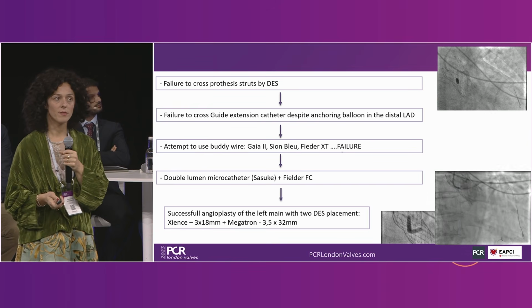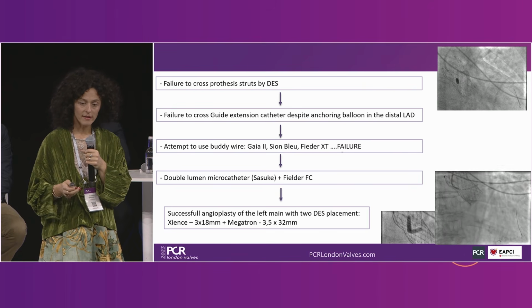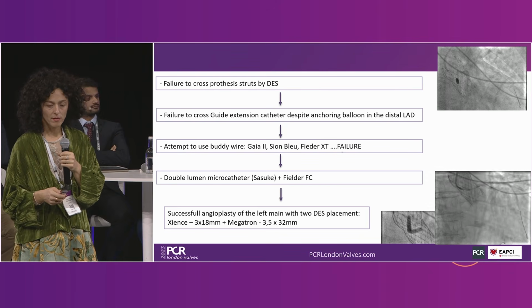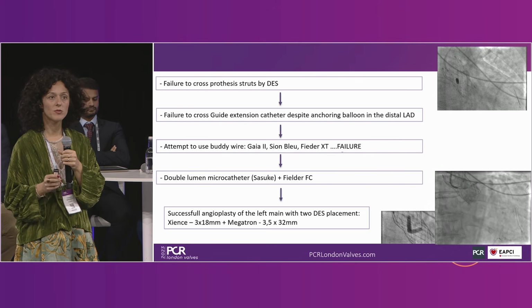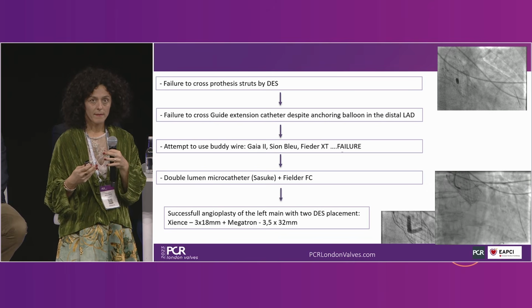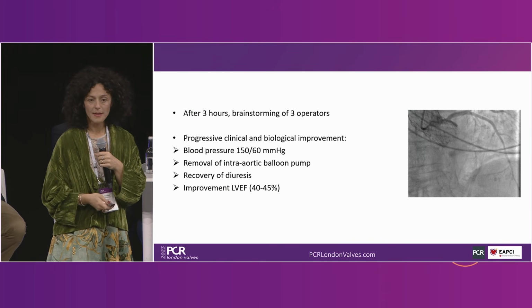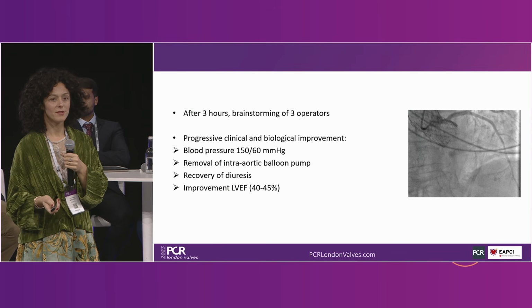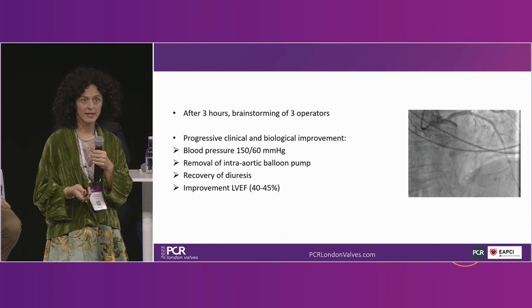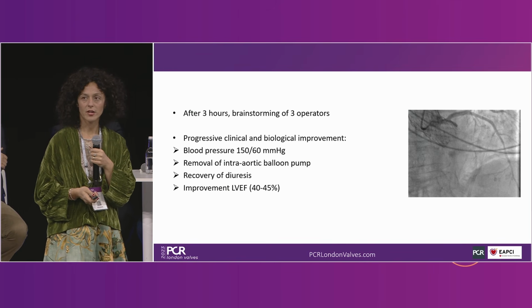this coronary ostium and reperfuse the left coronary artery, with the detail that we could perform a sort of chimney, of course post-valvular implantation, but with 2 stents because it was impossible to go through with a longer stent. So we had to put 2 stents in overlap between them. Finally, after 3 hours of procedure and brainstorming of 3 operators, we could achieve success. The patient improved clinically and could recover an acceptable left ventricular ejection fraction in the following days.